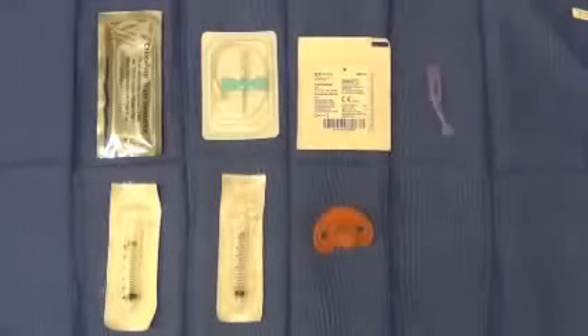The equipment required for arterial blood sampling is as follows. Chlorhexadine or betadine solution to sterilize the insertion site and surrounding tissue. Typically, betadine is utilized on infants weighing less than 1,000 grams. Chlorhexadine is utilized on infants weighing greater than 1,000 grams. Please refer to your institutional guidelines to determine which agent is appropriate.